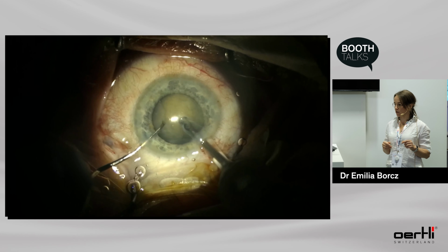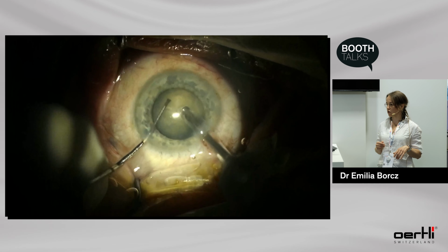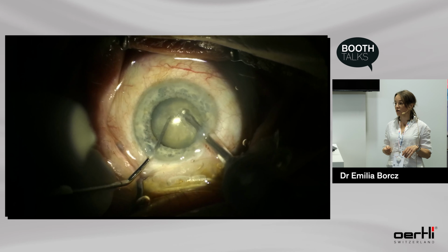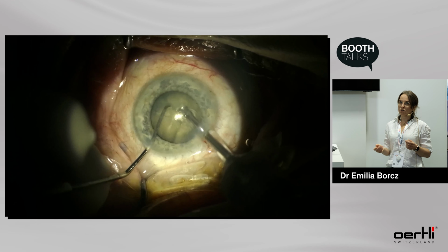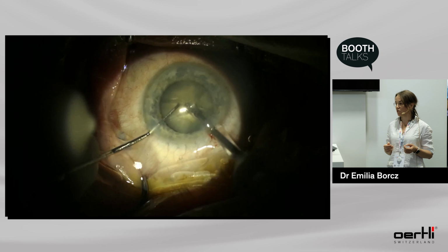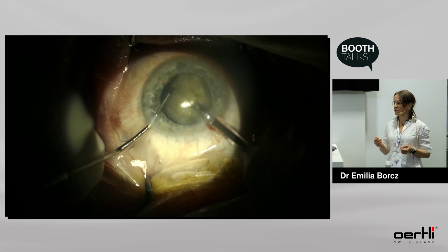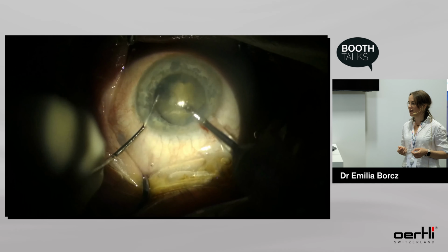And here I enter the central part of the lens, and I can chop it with my chopper. With very high holdability, I am sure that I will not lose the lens. I work on high occlusion. If we work on high occlusion, it means that we do not let too much BSS enter the eye, so we do not rinse endothelial cells, so the cornea is much better. This movie is from Venturi pump, so you can see how it jumps into the opening, like the vacuum cleaner that we use at home.